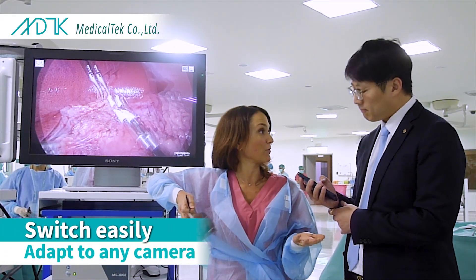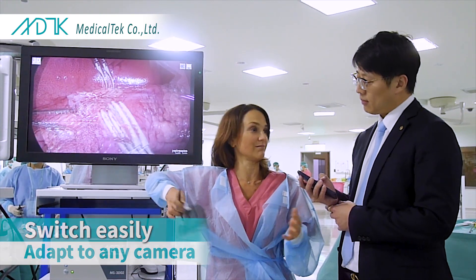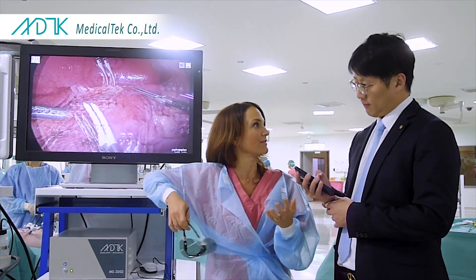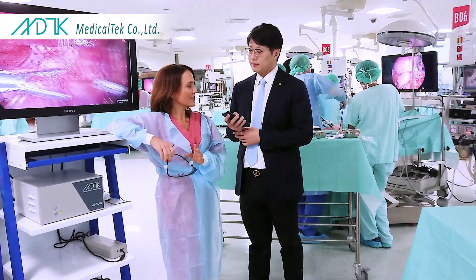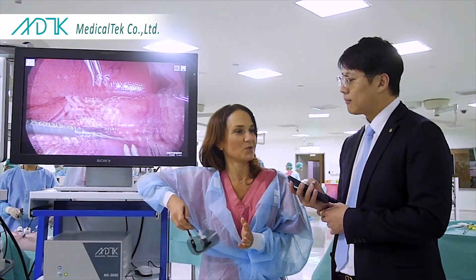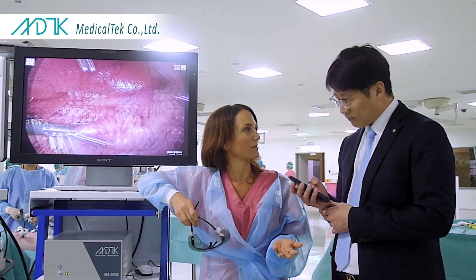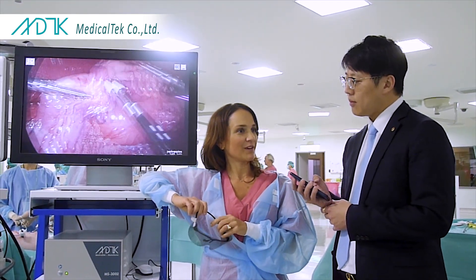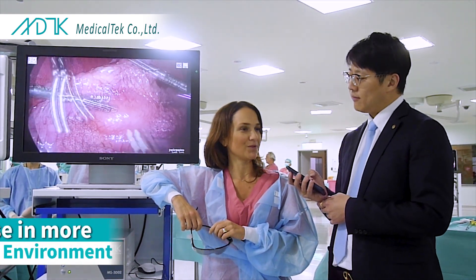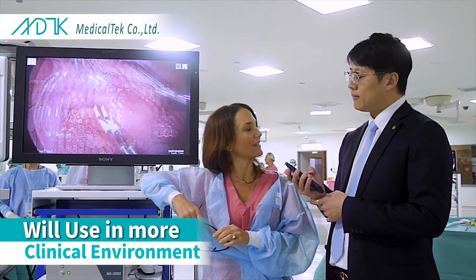You can adapt it to any camera you like, you could use it the full day, you don't have to re-sterilize your camera, and honestly I could not tell the difference between a real 3D and the monostereo. So up to now I am very intrigued by the system and I am looking forward to using it in a more clinical environment.